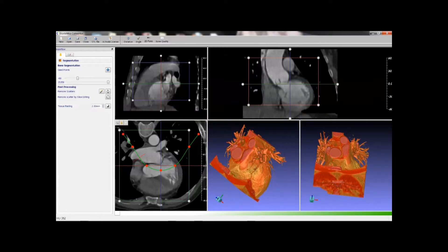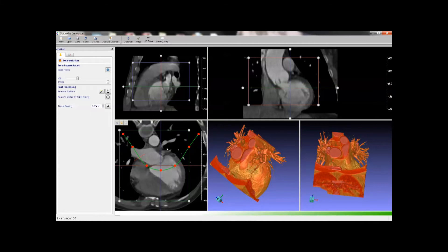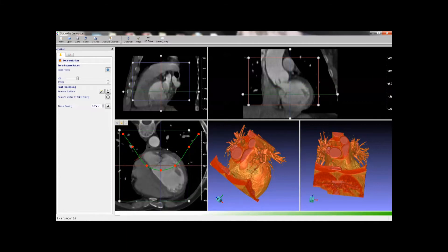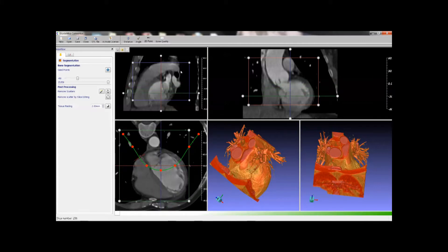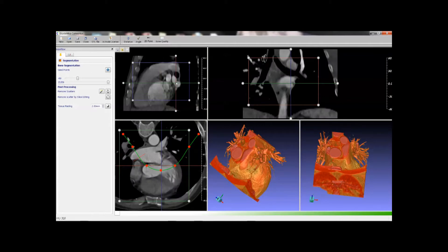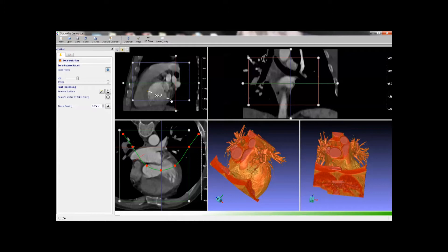Use mouse wheel to scroll through slices. You can also create dimensions and angles.